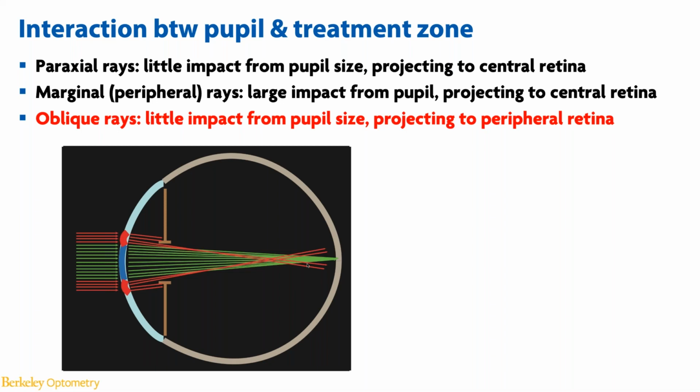And so these rays get a lot of input from the paracentral steepening, and the pupil size plays a huge role in limiting or allowing how much of the peripheral rays are getting into the visual system. But because the incidence angle is 0, so it's parallel to the optic axis, it's still mostly affecting the image quality of the central area of the retina.